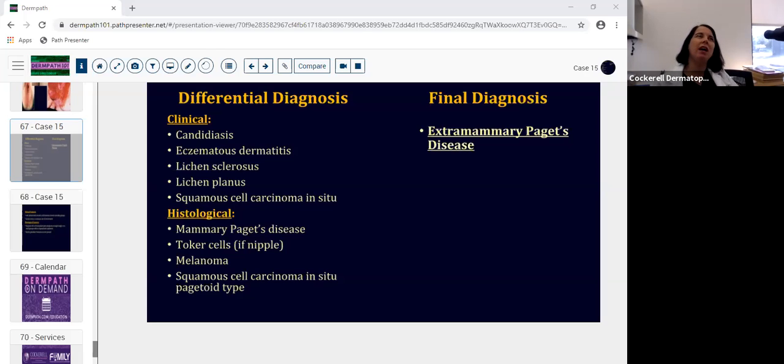And if this is a male, you might want to put a PSA, a prostate specific antigen, on those cells to see right away if it's positive. You could say, hey, it's coming from the prostate. Yippee. Oh, that would be great. And if you want to try to prove it's colonic, you might do a CK7 negative, CK20 positive. If it's secondary extramammary Paget's, it might be coming from the perianal colonic area. It could be coming from a bladder adenocarcinoma, which is rare, but you can see urothelial adenocarcinoma. It can happen. And then the prostate, it can come from the prostate.